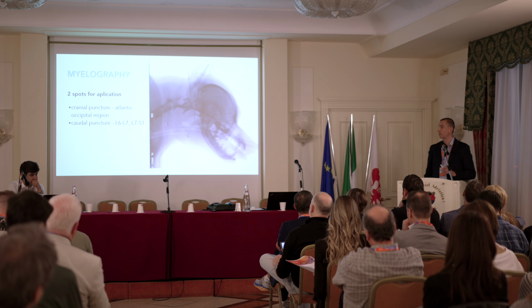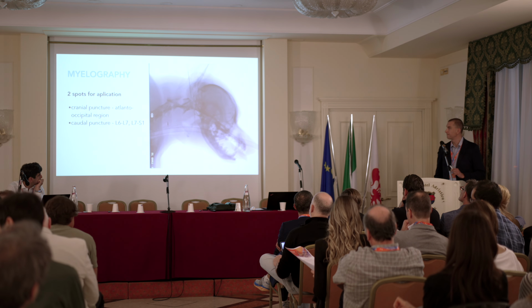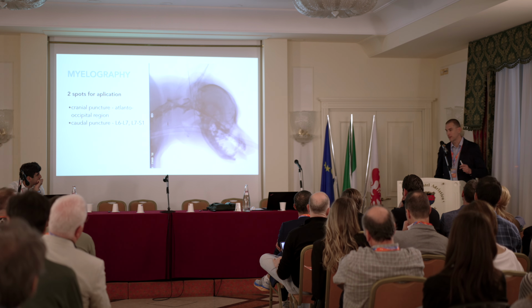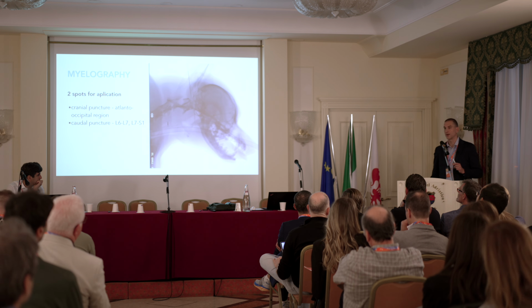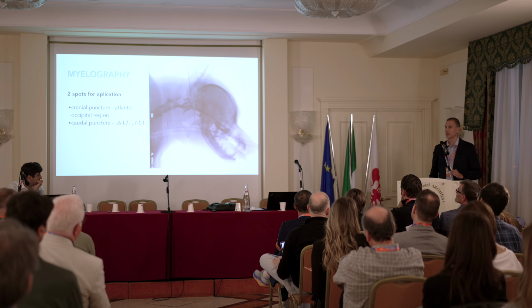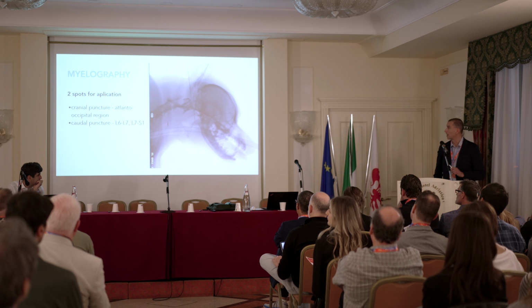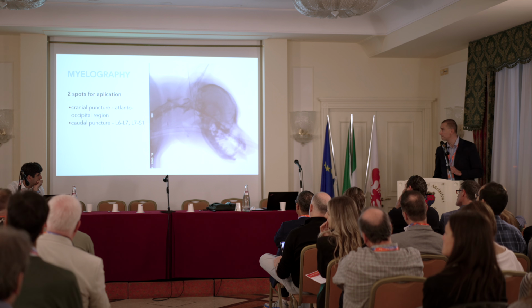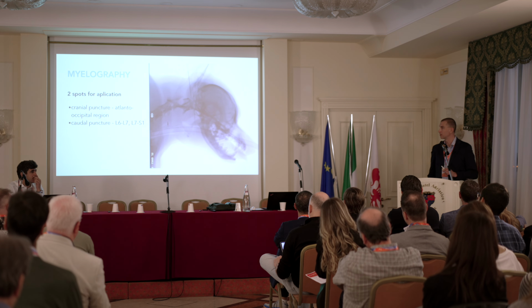L7-S1 is better, but usually, to be honest, sometimes it's easier to go a little bit higher with fatty animals, or if they are not in perfect condition. So sometimes I use L6-L7. I think it's not an error, but the right spot for application for caudal puncture is L7-S1.